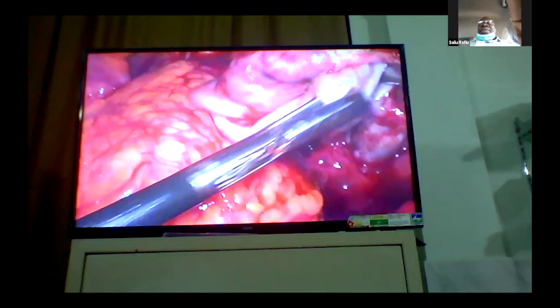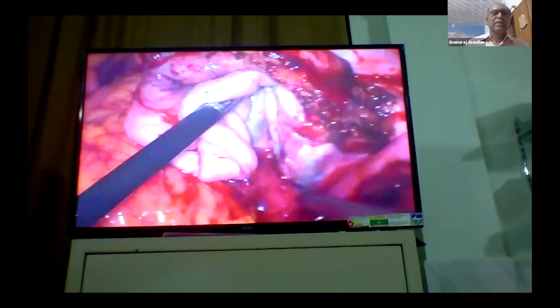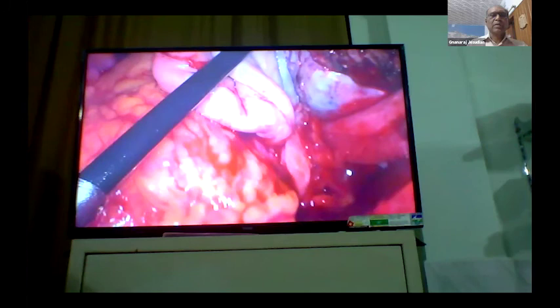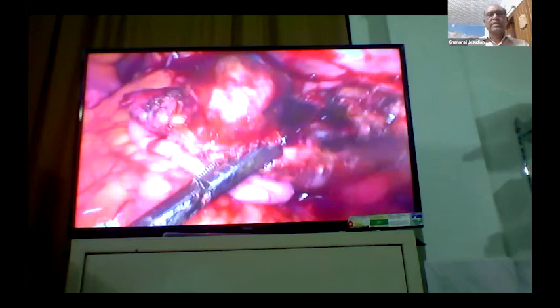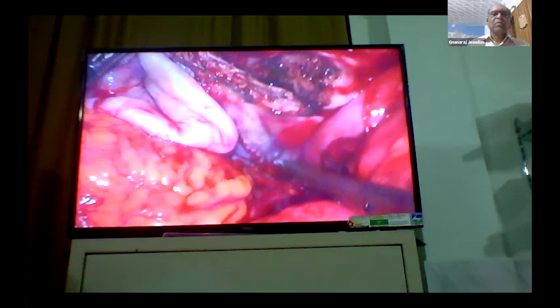So what he's using right now is a tooth grasper so that it gives a better grip to hold. And you can also use the suction apparatus for sort of blunt dissection. Now what you can see is he's lifting up one portion of the wall of the ovary. And what he'll probably do is use the vessel sealer to cut.